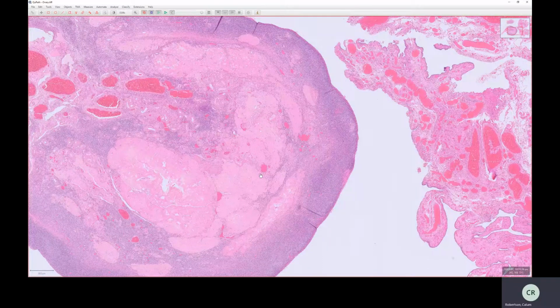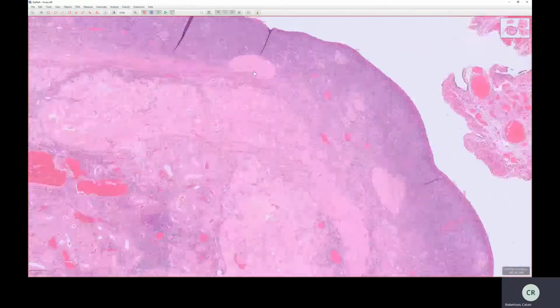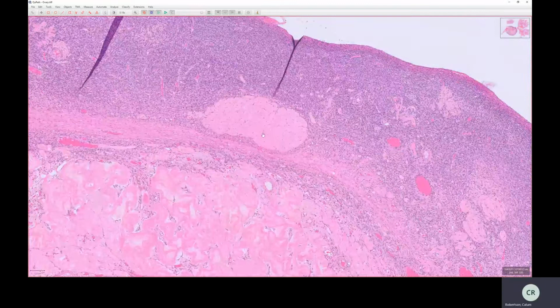Now, under normal physiological circumstances, follicles contain oocytes. During pregnancy or during the ovulatory cycle, these will rupture to expel an oocyte, and the follicles proliferate and become the corpus lutea, which have an endocrine role which supports the pregnancy. However, after the ovulatory cycle or after the pregnancy, these degenerate and become scar tissue, which we call the corpus albicans. And this is an example of that here.